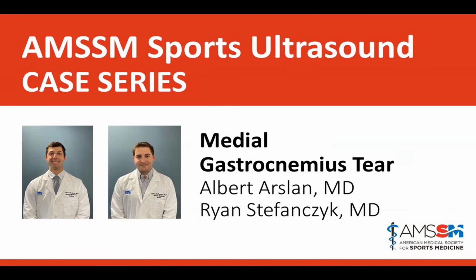And that's actually a big guide for me on when I start to return to strengthening activities: when the dyssynchronous motion that can occur with the higher grade tears has resolved is when I oftentimes start moving people forward. So like you got a re-imaging at 3 weeks, I'll frequently briefly re-image these patients at intervals every couple of weeks, or depending on how things are going, to see where we are from a healing standpoint.